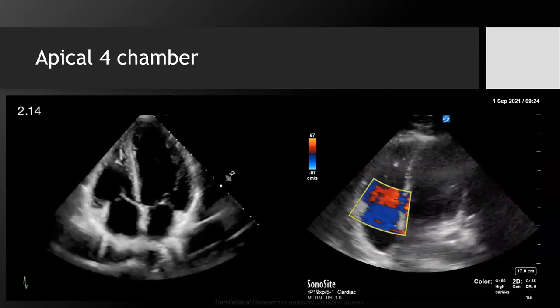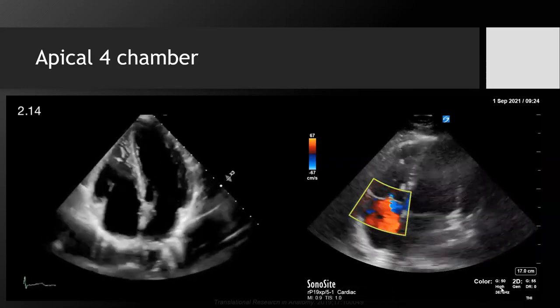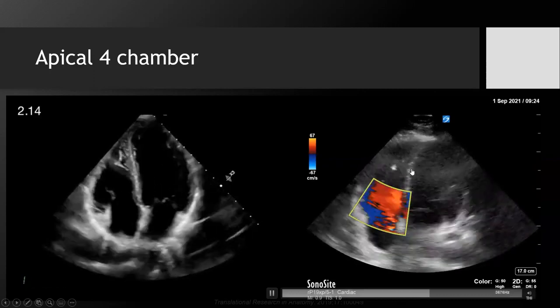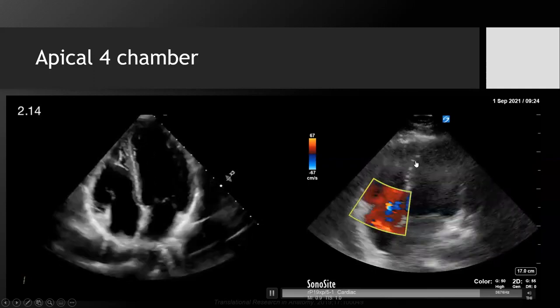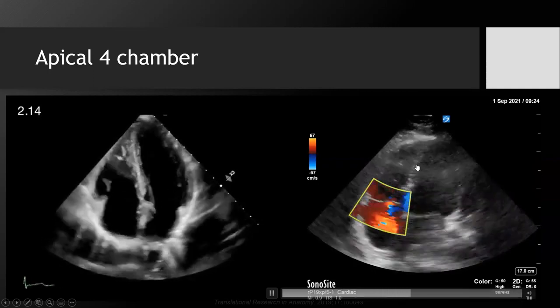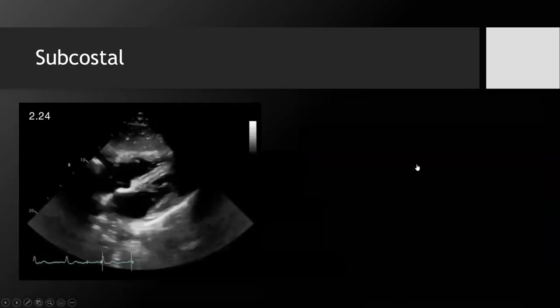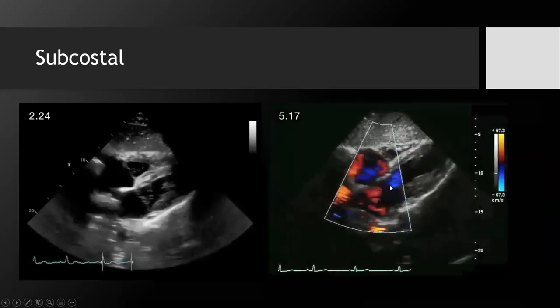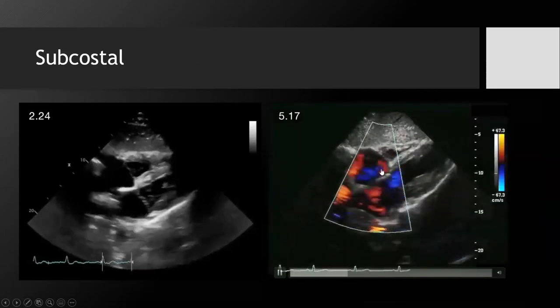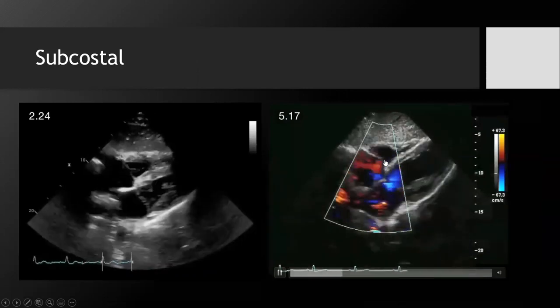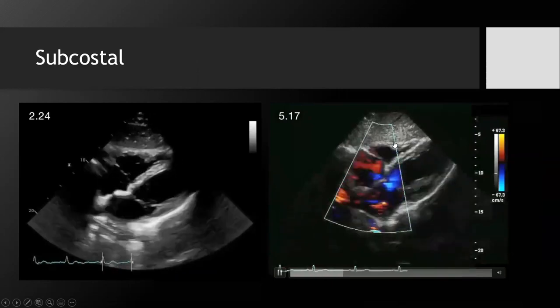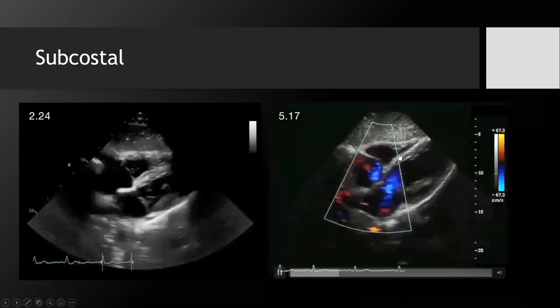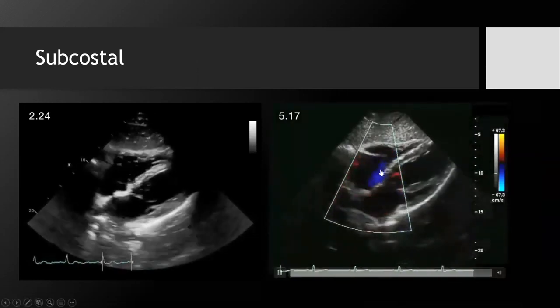Sometimes you won't get a good jet in the apical view and will get a better one somewhere else. Remember that you really have to be aligned with the direction of flow with Doppler — even though a 2D view might not look as aligned as you think, in a three-dimensional perspective you might still be better aligned. The subcostal view is usually deep and may have less gain and clarity, so color might not be as clear. But depending on orientation, you can sometimes also see a tricuspid regurgitation jet from this view.